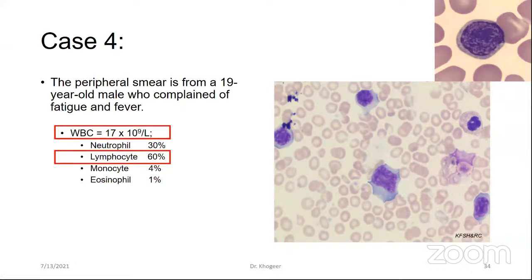Lymphocytosis in general can be divided into those with reactive morphology and those without reactive alteration. Causes of reactive morphology are usually viral infections like CMV, HIV, and herpes, although other bacterial infections may also cause increased lymphocytes, like syphilis.